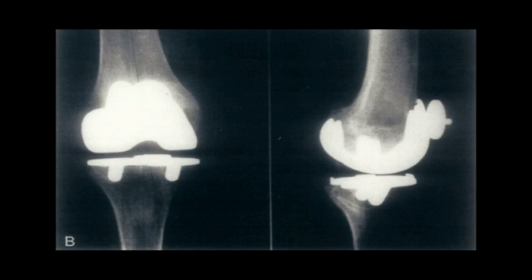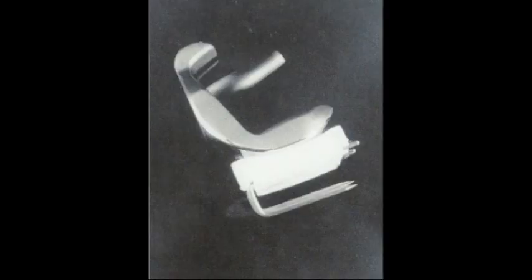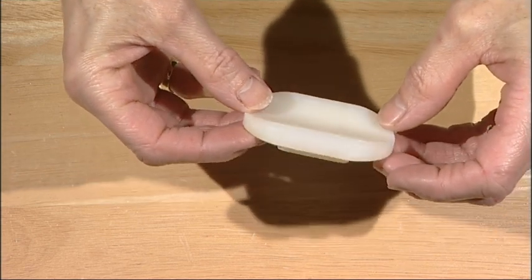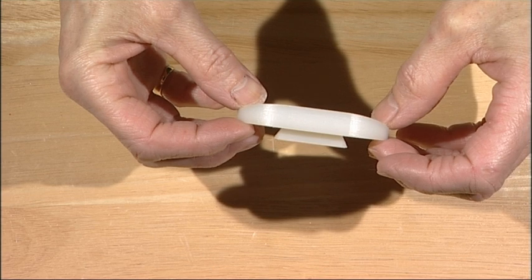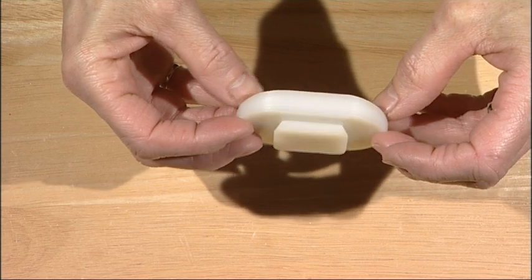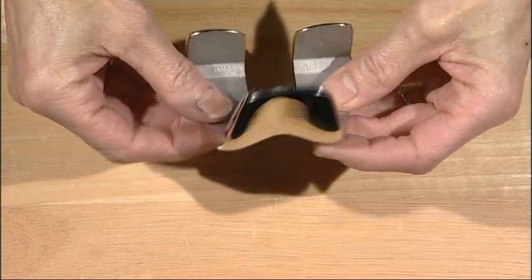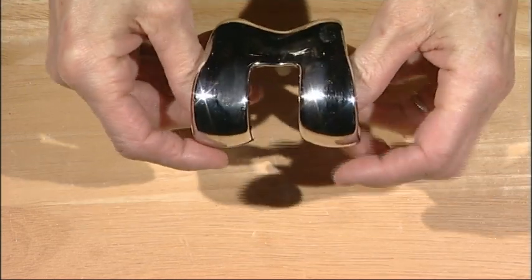Ranawat, however, joined with Walker, Insel and Burston to develop the total condylar replacement. In 1975, Freeman introduced the Freeman-Swanson knee, also called the ICLH, Imperial College and London Hospital, with a simple roller metal femoral component and small polyethylene trough to fit any tibia. The latter resulted in sinkage of the tibial component. This was overcome by enlarging the tibial component. A femoral groove was added to aid patellar tracking in the ICLH-2.